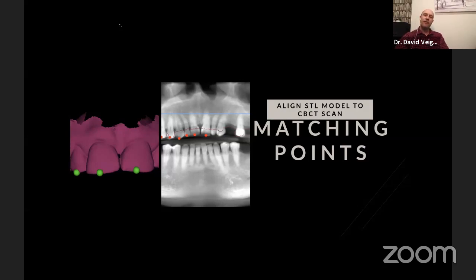I want to know where the tooth position is, because right when I scan them, I then have to scan them again to allow me to use my dual scan surgical guide procedure. So I'm actually exposing the patient twice, when really finding that initial bone volume doesn't give me anything that I need to know at that stage. So it's kind of a reverse way of looking at it.